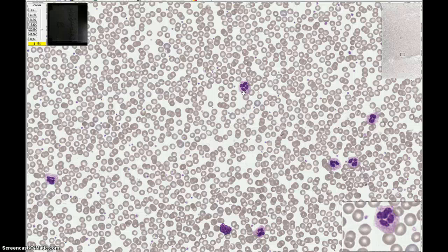Anytime you see a cell with a segmented or lobed nucleus, chances are it's going to be a granulocyte. Granulocytes include the neutrophils, eosinophils, or basophils.